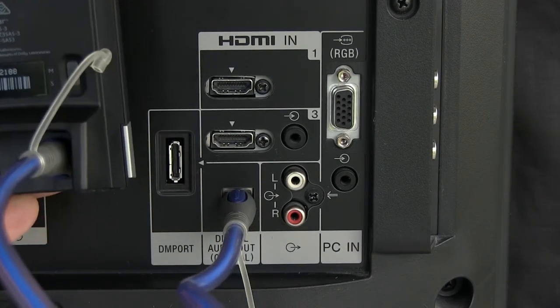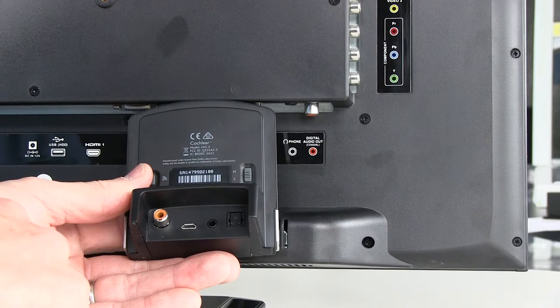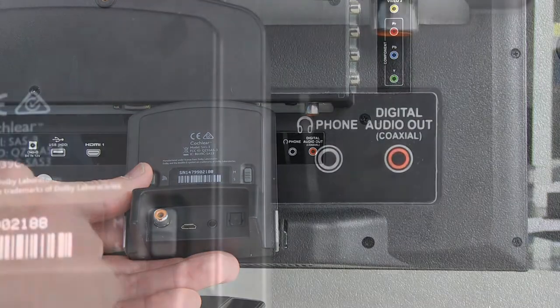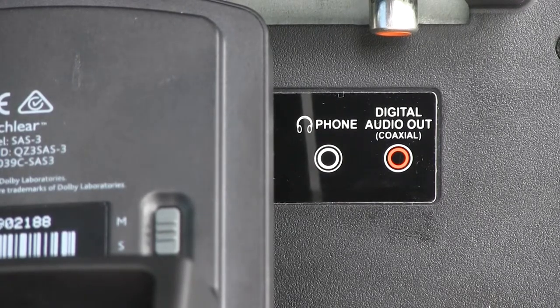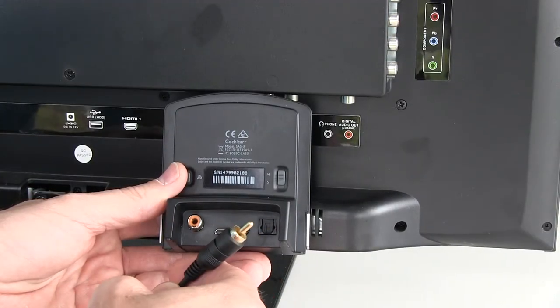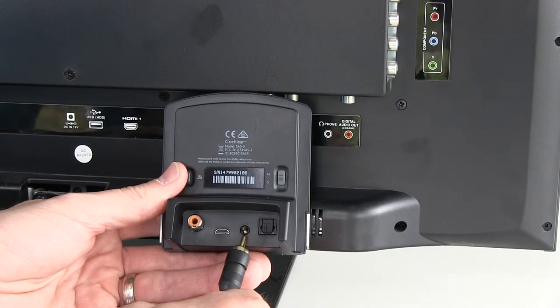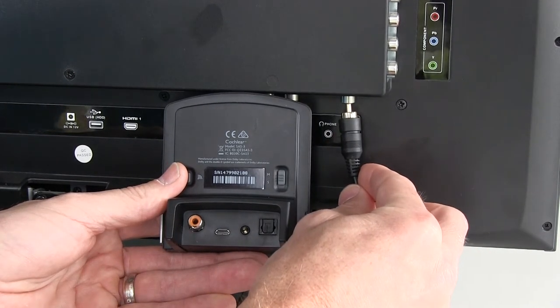The optical cable and the digital coaxial cable are not included in the TV streamer packaging, so that's an additional purchase. In some instances, you might find that your TV does not have an analog or RCA audio output jack, so you would need to use either a digital audio coaxial cable or a digital optical cable. A digital coaxial audio cable looks very similar to the analog audio cable but has a slightly different and slightly bigger plug — it will not fit into the analog plug and needs to go into the digital coaxial cable plug. One end would plug in here and the other end would go into the TV at the coaxial connection.